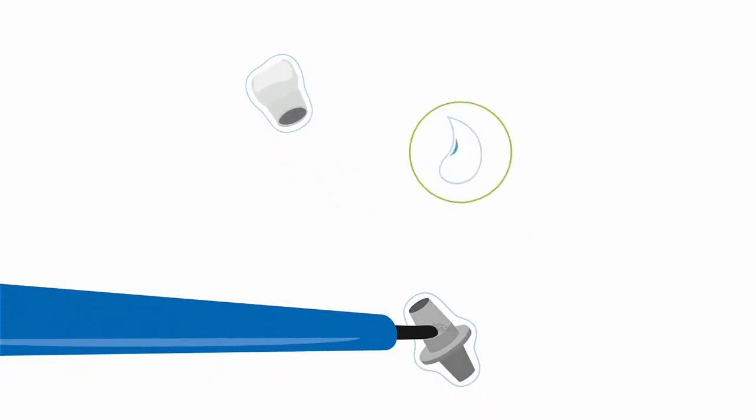To get the most durable implant abutment cementation, you definitely need to roughen the surface first. Therefore, use sandblast with low pressure, then rinse and dry both surfaces.